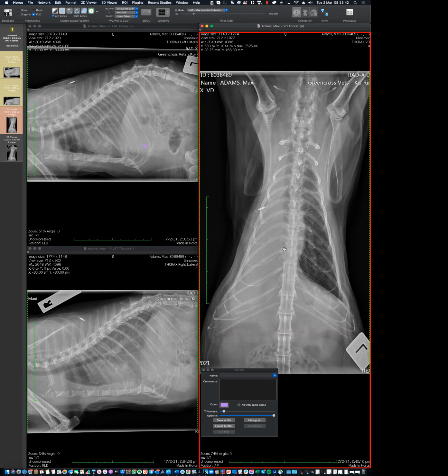Well, yeah, that's a good question. I'm going to try. I'm not sure you can see that. An extremely important point, and the important point is, how can we reconcile all the images? Is there something that doesn't fit? Makes sense?